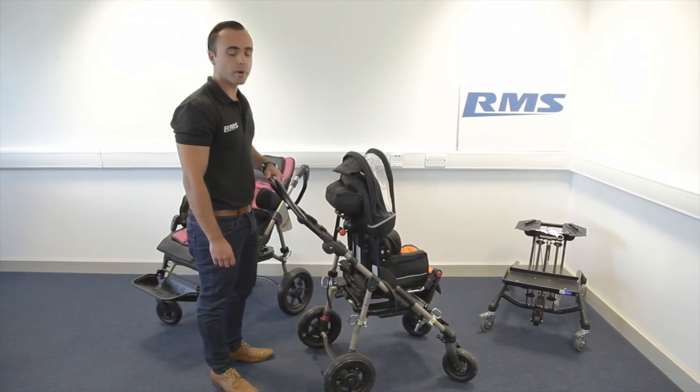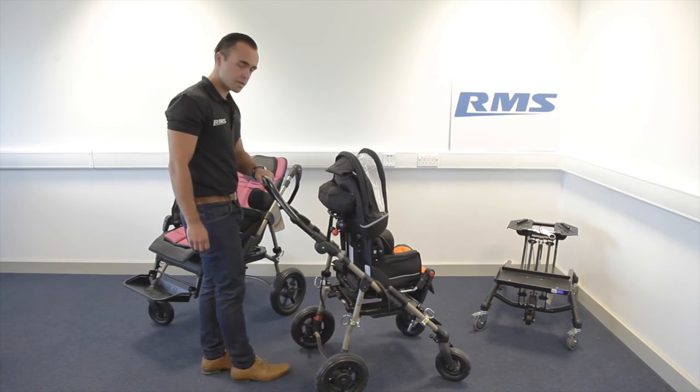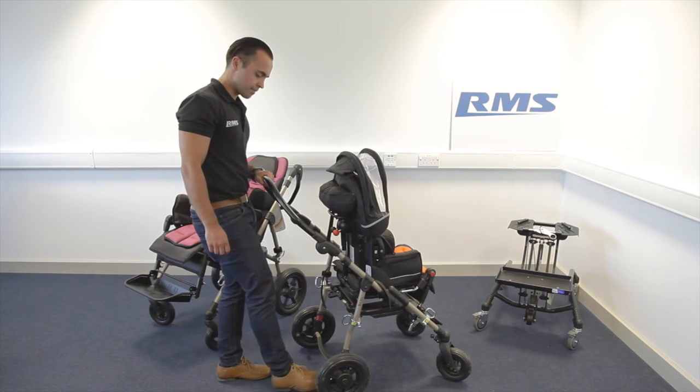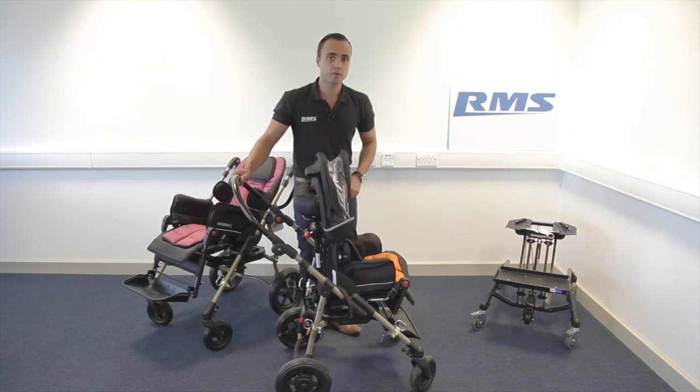You have two brakes here — just press and release. You can also lock the front wheels.